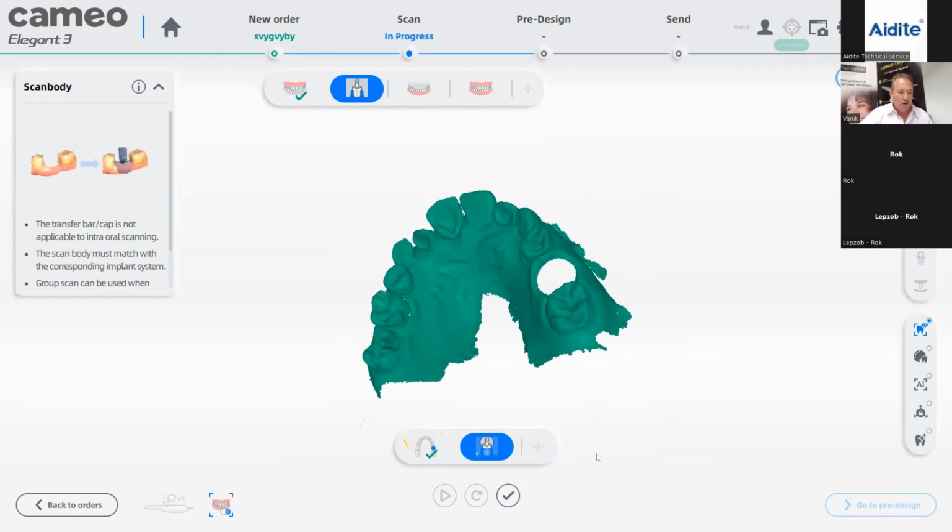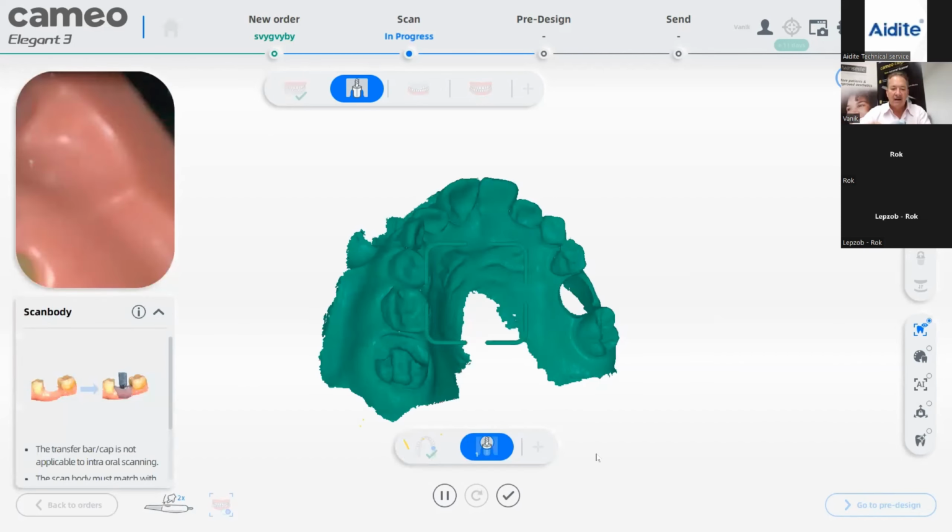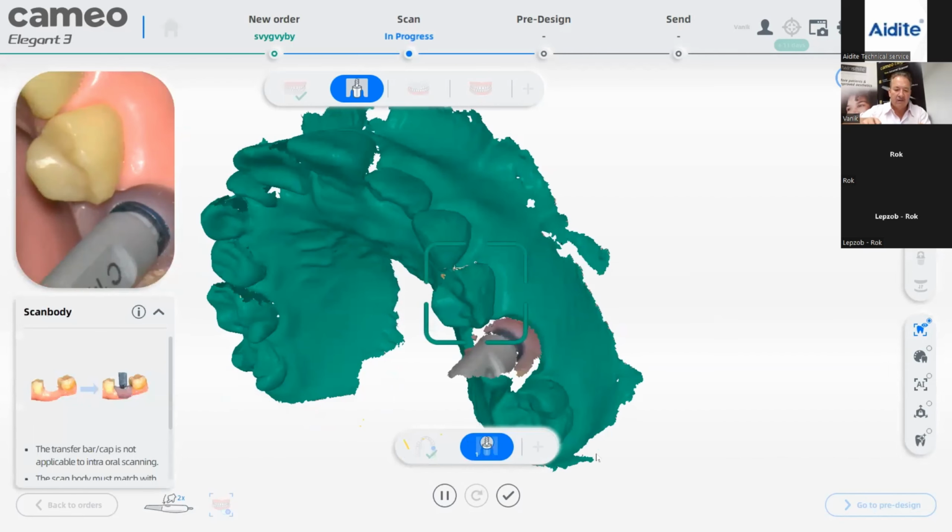And now you take your model, I've got a scan body here. So you get the scan body of that implant system, you put it in here, and always make sure that the scan body looks to the labial side, okay? The flat area should look to the labial side. I'm not going to screw this in because I have to unscrew it and screw it, I lose too much time. But normally you have to tighten it very well. Now the next thing is you take your scanner and you just scan this part. Okay.